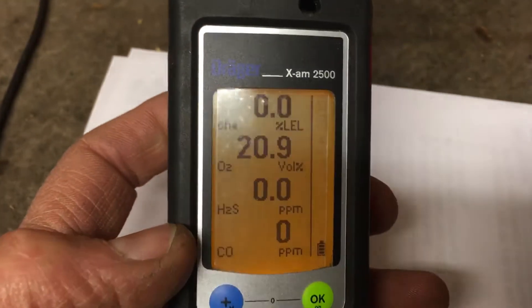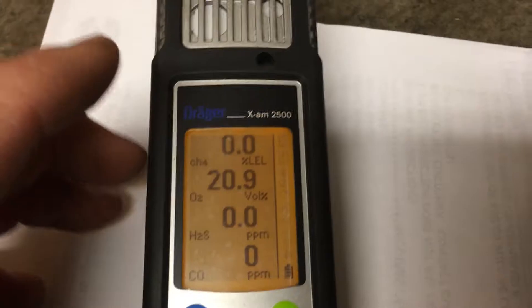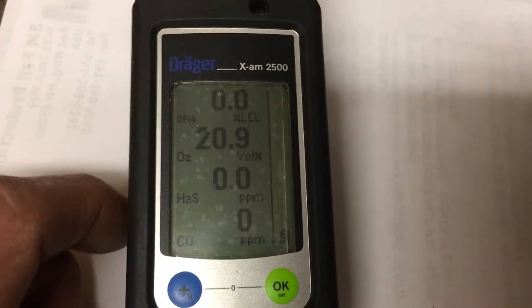It'll eventually go back to the main readings on its own, or you can push the blue button to go back immediately. Everything is zeroed: 0, 20.9, 0.0, 0.0. Everything should be zero except O2, which should be 20.9. That's the fresh air cal done.